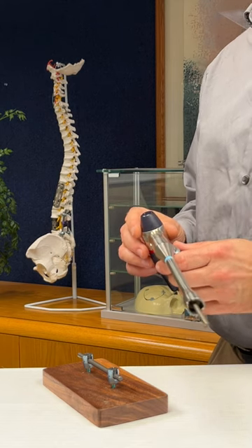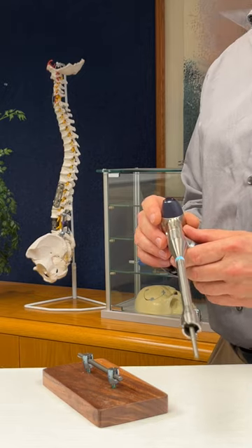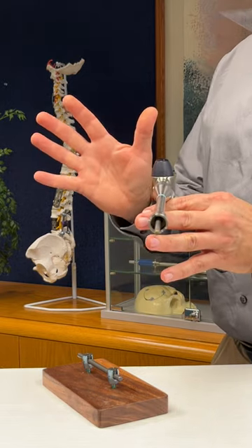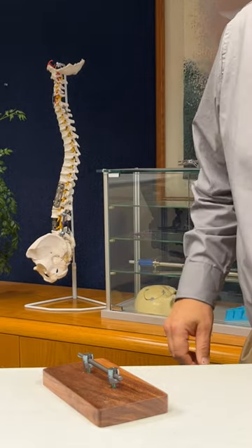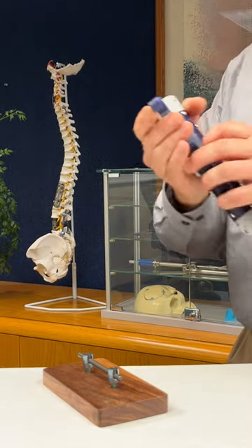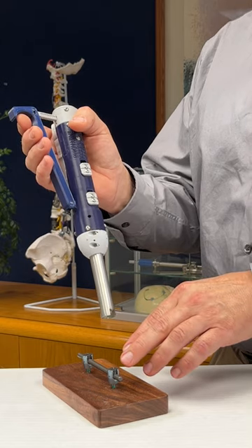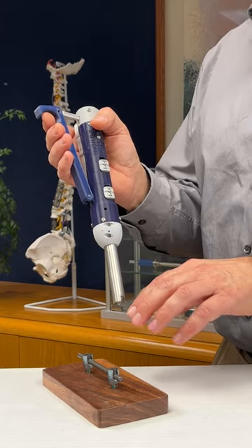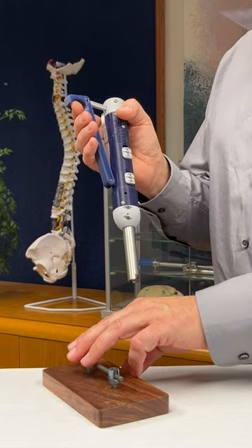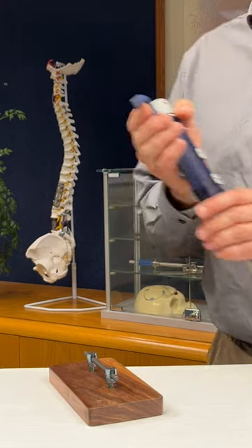As discussed in our earlier video, set screw tightening of any top-loading pedicle screw system historically has always required the use of two hands and two instruments. In the first video, we showed how the manually operated counter-torque screwdriver was used to tighten a set screw without having to use a second hand or second instrument to stabilize the other implant components or to protect the patient's spinal column.